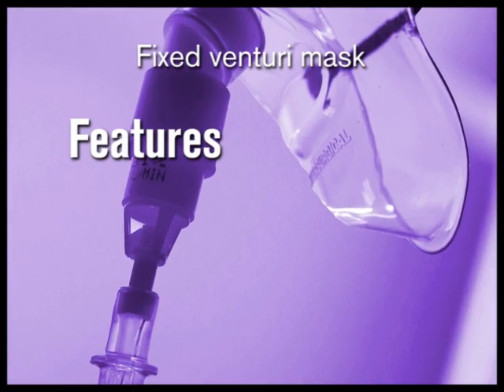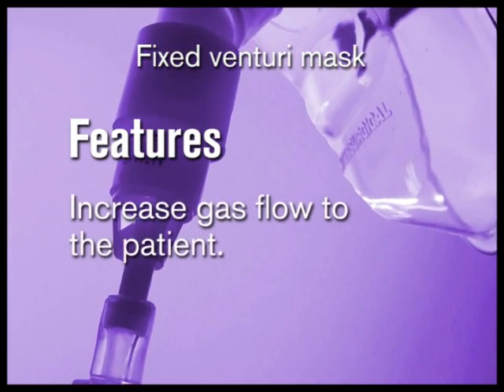Clinically, Venturi devices are used to increase gas flow to the patient because air can be entrained using the Venturi principle.